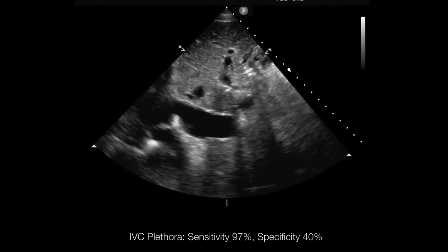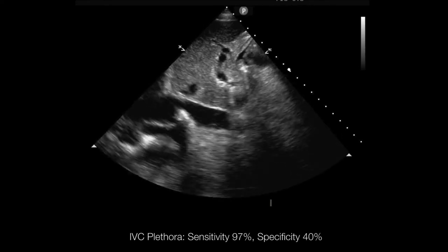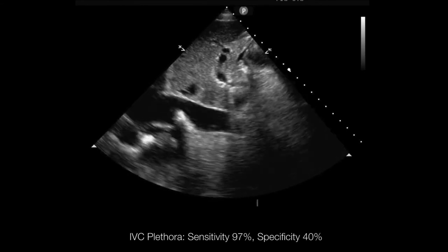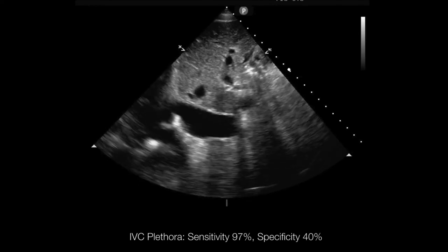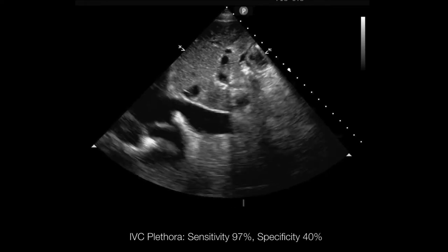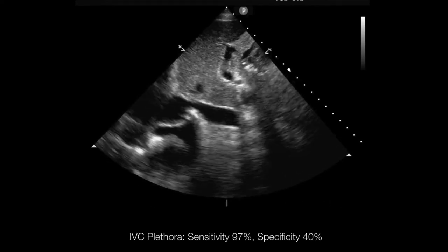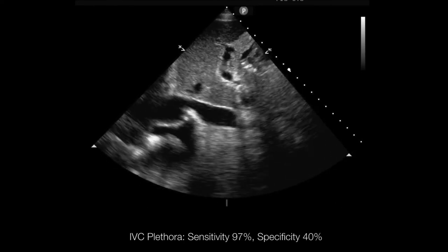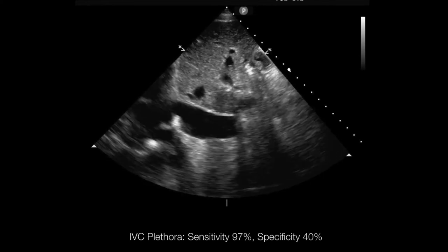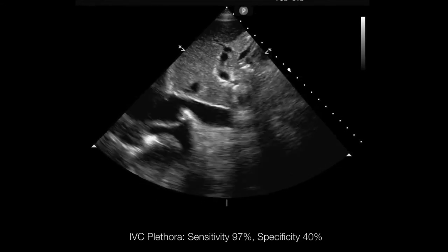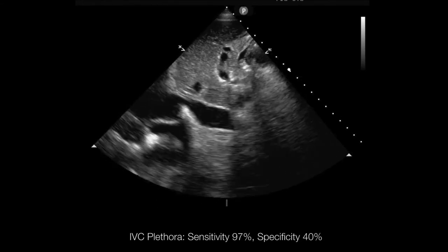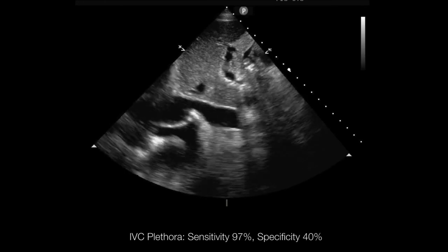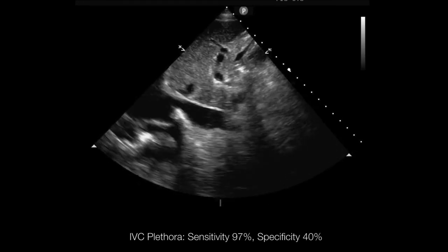Normal IVC is considered less than 2 cm with about 50% collapse. Someone who's hypovolemic will have greater than 50% collapse and be less than 2 cm. Someone with elevated right atrial pressure should have less collapse and be greater than 2 cm. That 18% number has been studied and works when you bloodlet medical students, but when you apply it to a 90-year-old in a car crash or a 16-year-old who was shot, those numbers don't hold up. I use a qualitative assessment and correlate clinically.